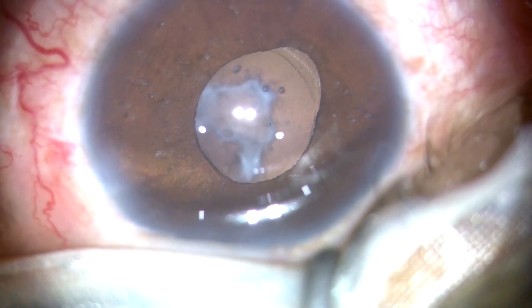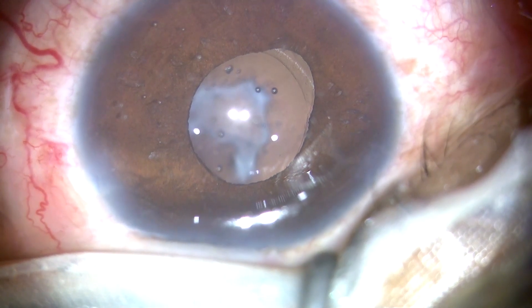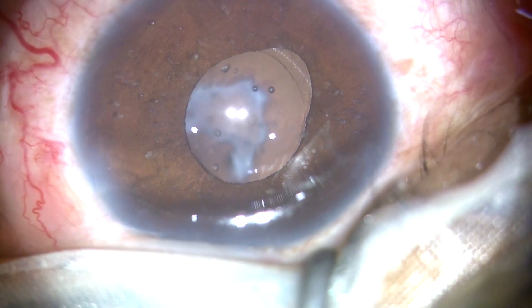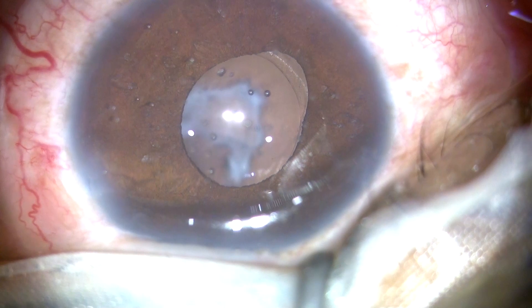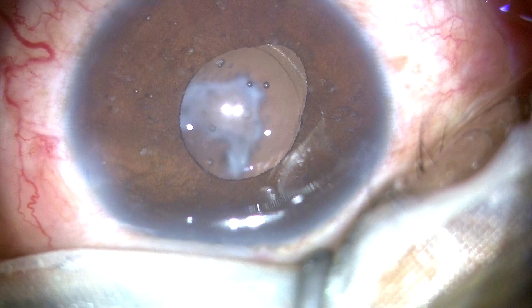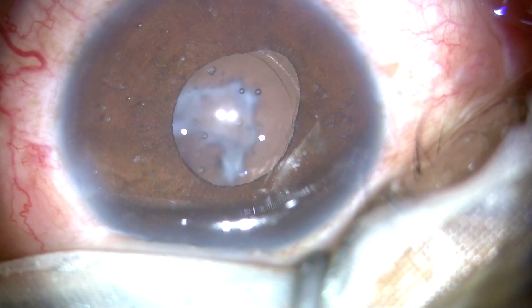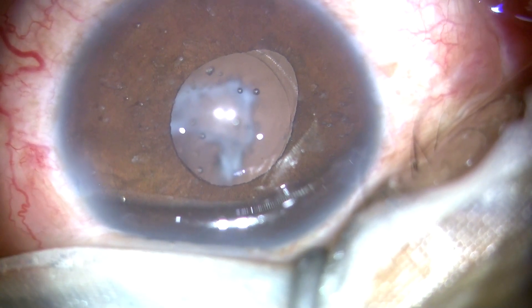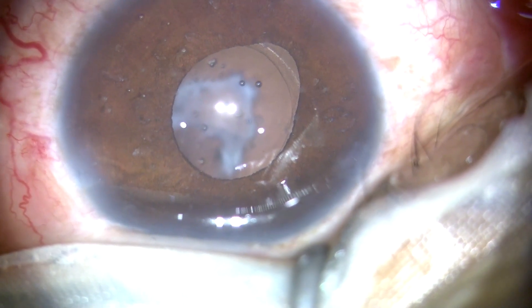What do we see here? A thick plaque on the posterior capsule. It is so thick that if I leave it, the patient will not have good vision. If I try to remove it, it is most likely I will puncture the posterior capsule. If I try doing a YAG capsulotomy in such a thick plaque, even that would not work.